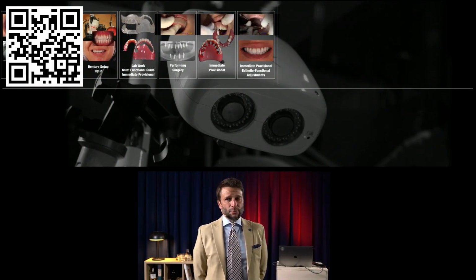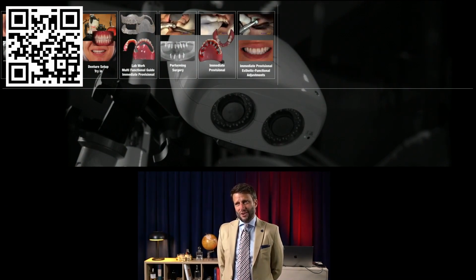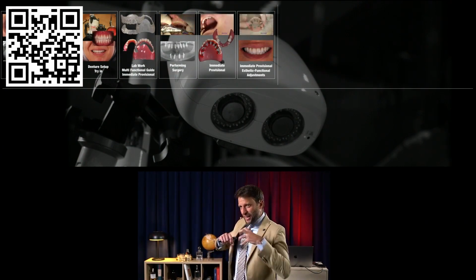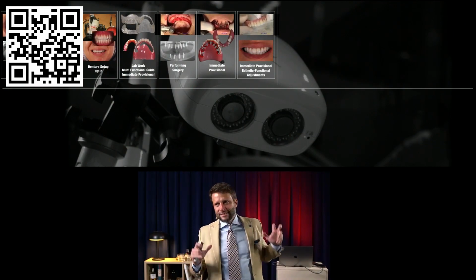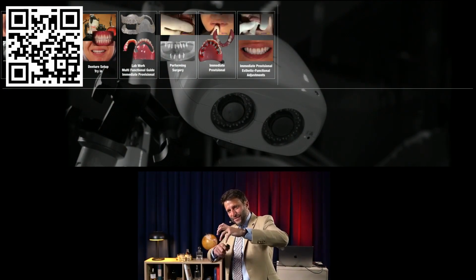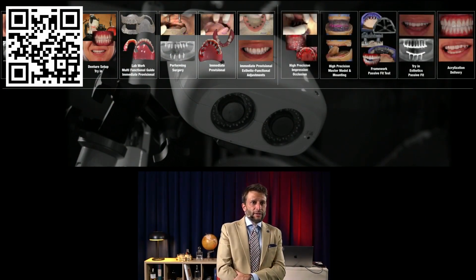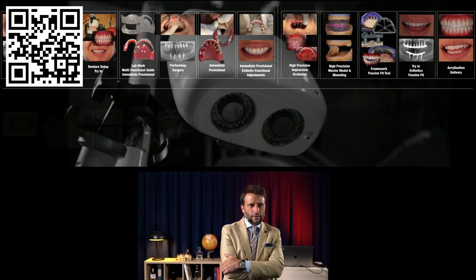And how many cases we ended up screwing, even though we knew it was not ideal, and the passive fit was not ideal, and the bridge was kind of screwed into the implants, and you could hear the ceramics crack as you were screwing the last implant. It was crazy, really crazy. And how many steps we had to go through all the way to final delivery.